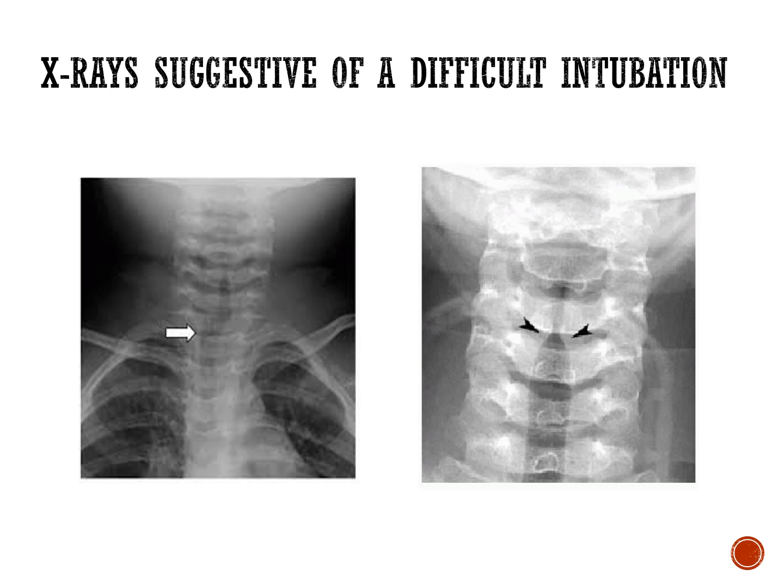Nonetheless, irrespective of what the cause is, this may be a clue that it may be difficult to actually intubate. You may be able to visualize the glottis just fine, but getting that tube to go through the glottis, and advance through it adequately, may be another thing altogether. So these might be some clues to say, I need to have my difficult airway box handy, and/or perhaps need to defer to anesthesia to get this done.